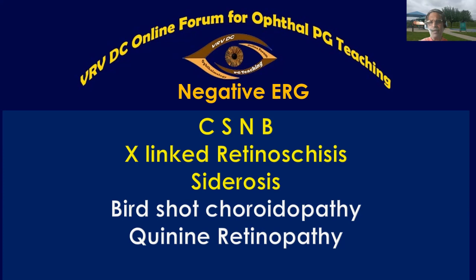One more thing I can tell, sir: the ratio of B wave by A wave, B by A. You know B is always positive, A is negative. The ratio is always more than one. When the amplitude of the B wave is coming down, this ratio will get altered.